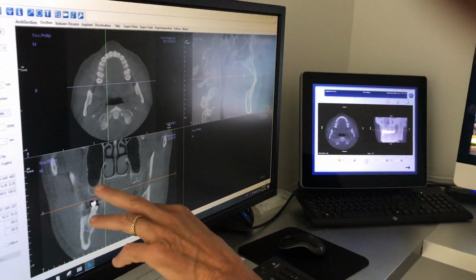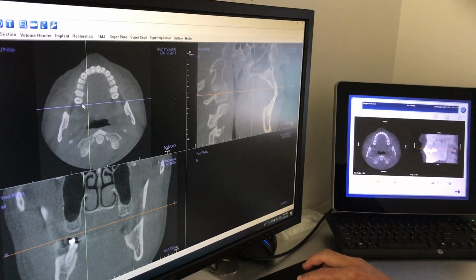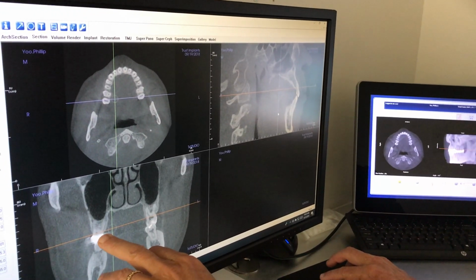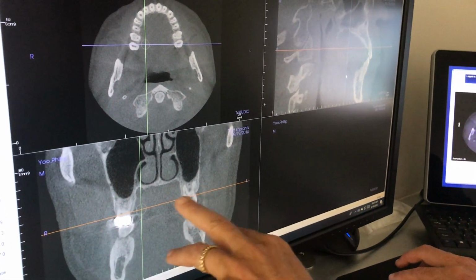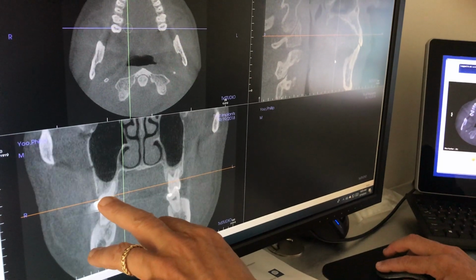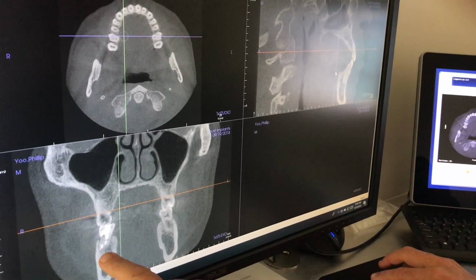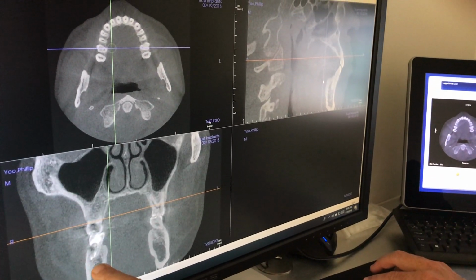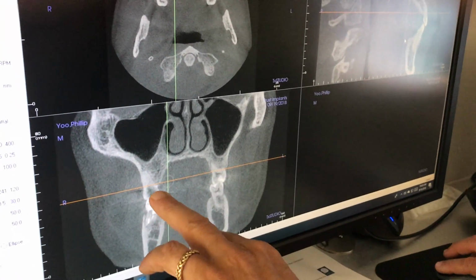Okay, so there the sinuses are from front to back, and as we come forward, now the teeth come in, and can you see how this X-ray can show an abscess that you couldn't see at all in conventional X-rays? When we're looking at these, we can see teeth that have died that we have no idea have died. As a matter of fact, there's the root canal tooth, and you can see that the root canal filling goes all the way to the end. Well, you can't see this view on any other X-ray. Now, why is that bright versus this? This is metal or filling material inside.